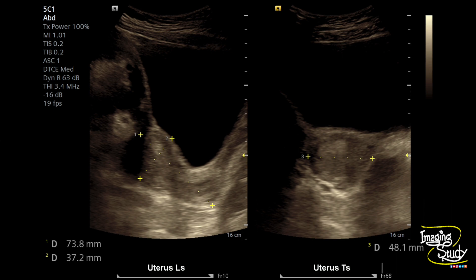Here you can see the longitudinal and transverse sections of the uterus. It looks quite normal — you can see the endometrial echoes. The urinary bladder also looks quite normal.